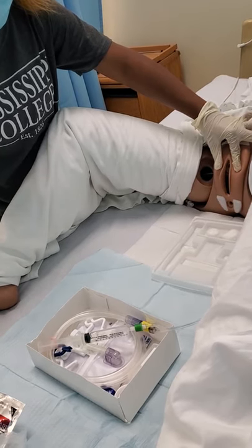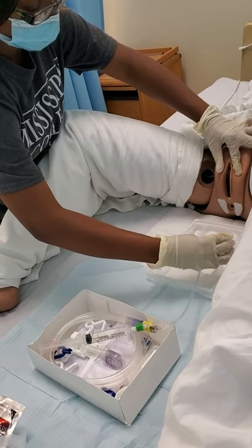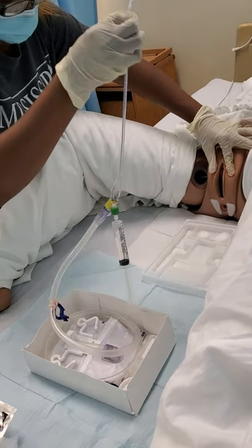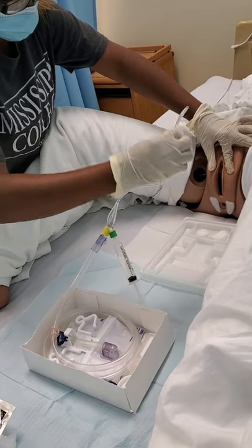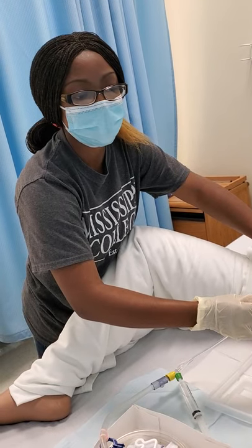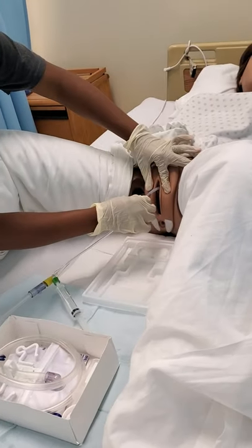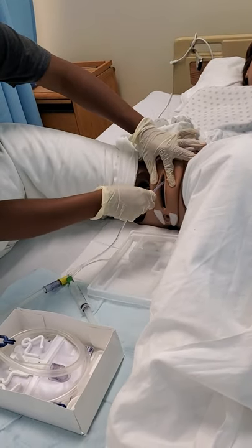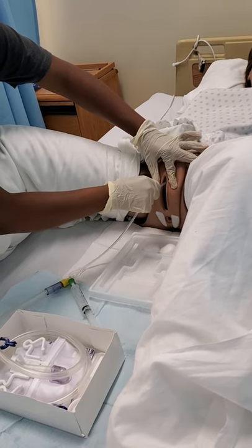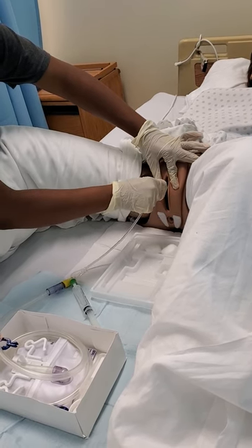Okay. Now I'm going to insert my catheter. And for a woman, it should go at least 2 to 4 inches, and for a male, it should be 4 to 6 inches. All right, going to insert and making sure not to touch with the other glove. Okay, now I see urine. Now I'm going to push a little more.